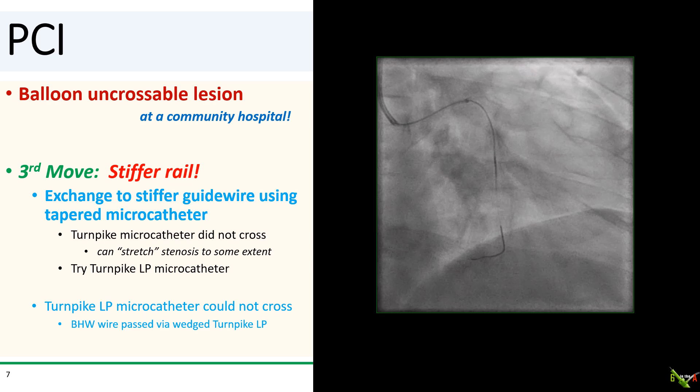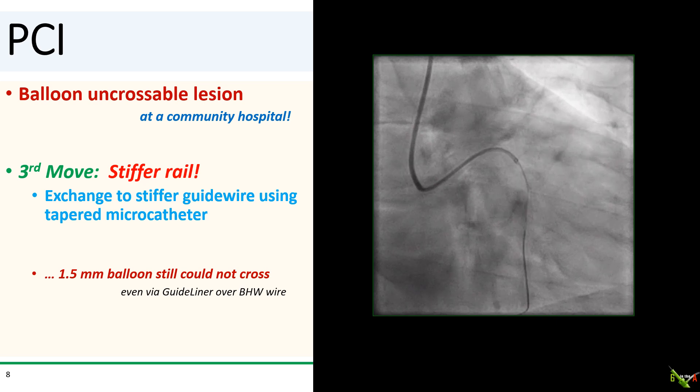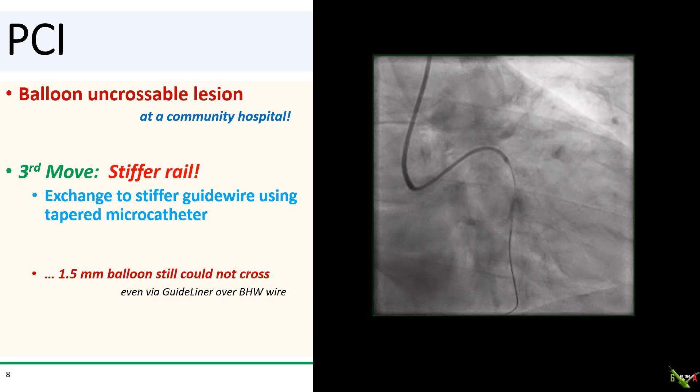My third move is to try to improve my rail. I'm going to change my BMW wire to something stiffer, such as a BHW or a Grand Slam. To do that, I generally like to use a microcatheter with a tapered tip, such as a Turnpike. The tapered tip can sometimes stretch the lesion a little bit as you're advancing it. Unfortunately, the Turnpike could not cross the lesion. I then tried the lower profile Turnpike LP, but that didn't cross either. So we wedged the Turnpike LP as far as it could go and were able to get a BHW wire across the lesion into the distal circumflex. But despite using the stiffer wire and the guideliner, that 1.5 mm balloon still could not cross. We tried a 1.2 mm balloon, but that was unsuccessful too.